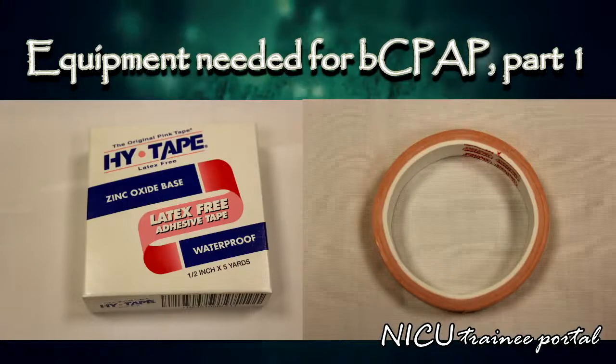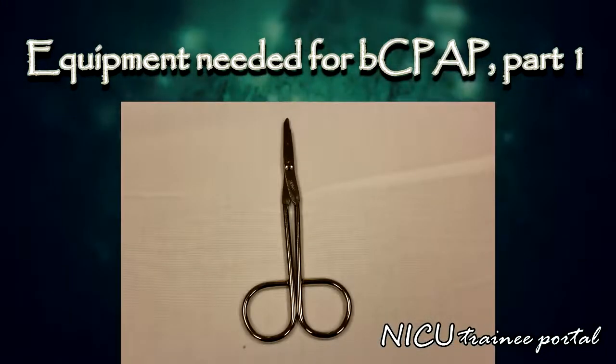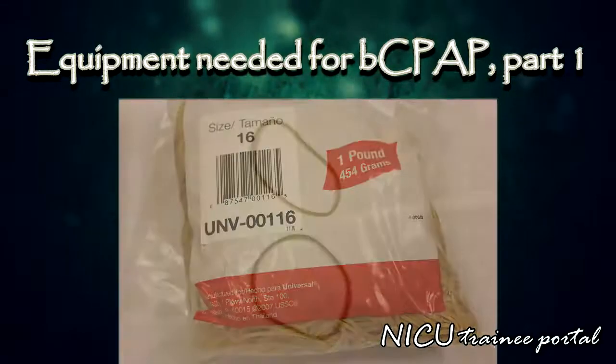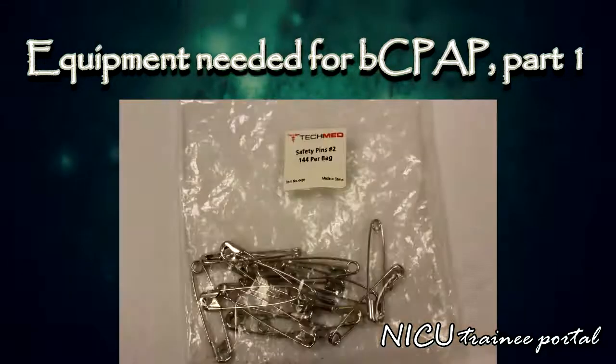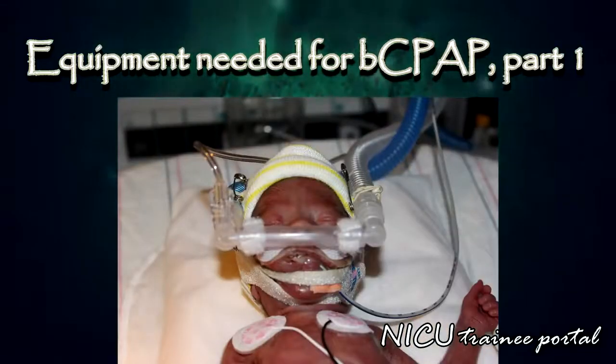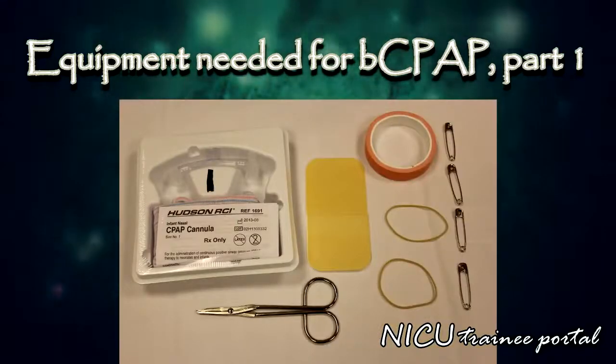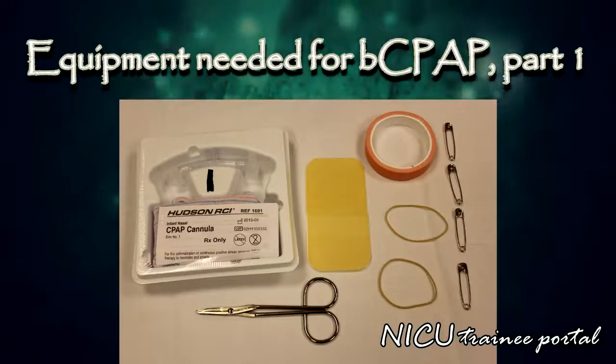Half-inch latex-free waterproof adhesive tape, a pair of scissors, 2 size 16 rubber bands, 4 size 2 safety pins. A chin strap may be required to minimize air leak from the mouth. Also, an orogastric tube is necessary to prevent gastric distension and can also be used for enteral feeding once the infant is stable. Now we are ready to set up bubble CPAP on our mannequin.